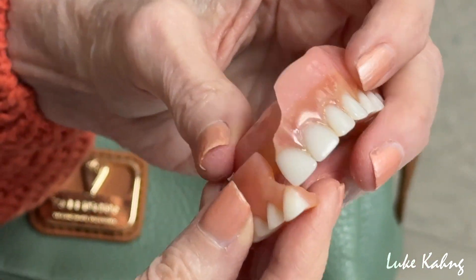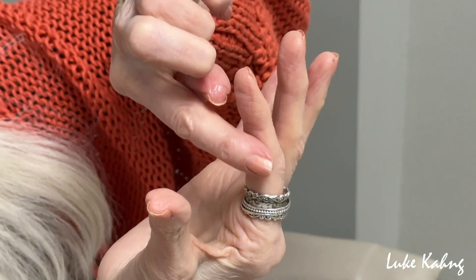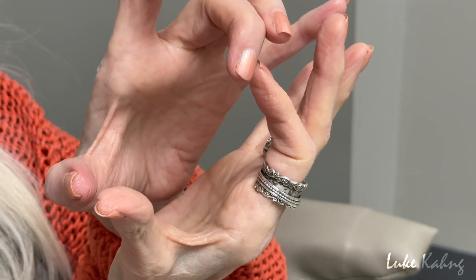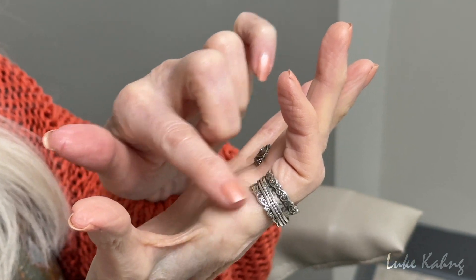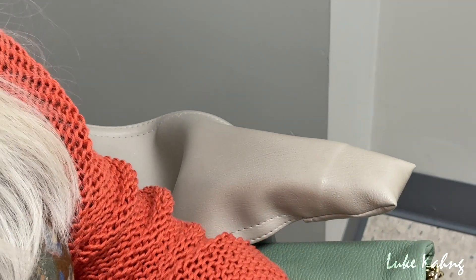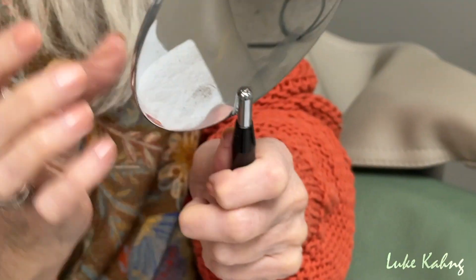And also, I don't know if this can be done, but right now they're a little bit more U-shaped. And if it's possible to not make it quite so U-shaped — a little bit flatter here, like open. To where? Just the front teeth, the very front teeth.